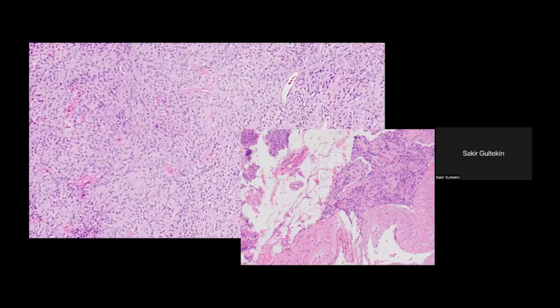On the right side, you see the white part is the fat again. So this tells a pathologist that you're out of the dura, epidural at least. So same thing happens in the cranium. When the meningioma goes extracranially, you can tell by the type of tissue that you give us that there must be some extradural extension. It could be bone, it could be fat, it could be fibrous tissue, etc., other than the dura. And you can see islands of tumor cells in this picture. Next.